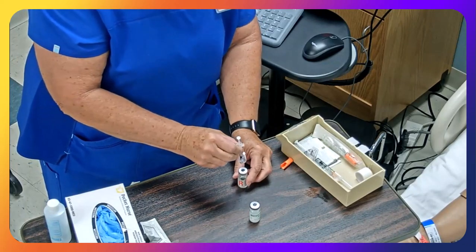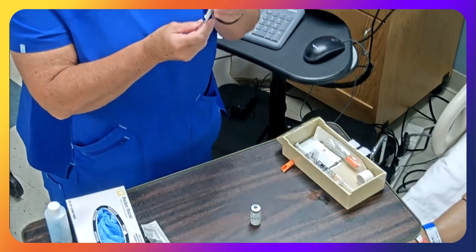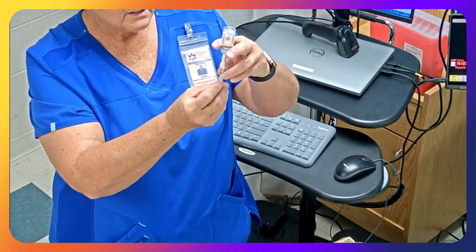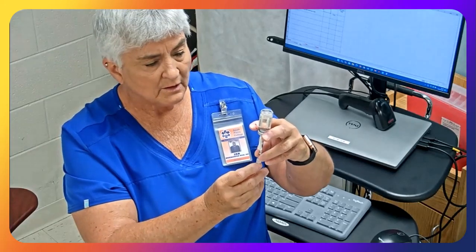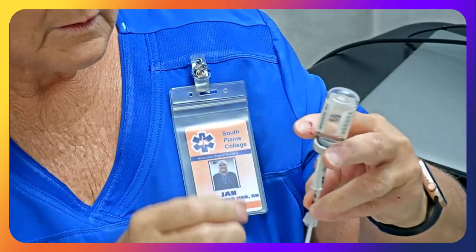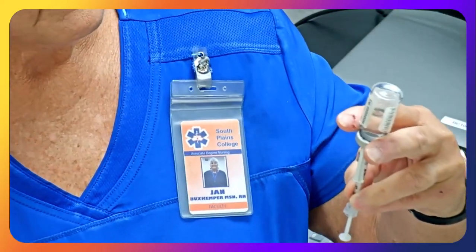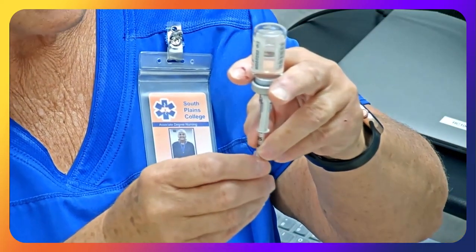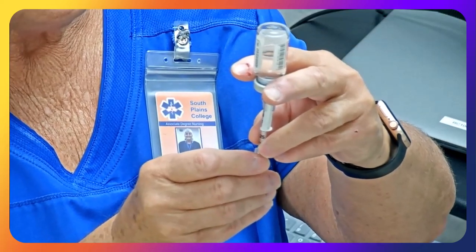Again, being very careful not to bend the needle. So I'm going to pull back to my 8 units. Make sure I get any kind of bubbles out of there. Okay, and I'm going to make sure that I have 5, 6, 7, 8 units.